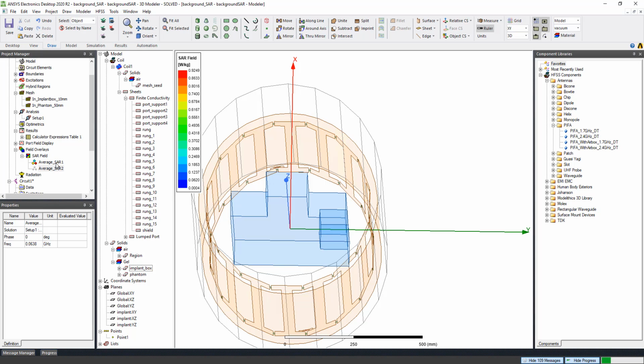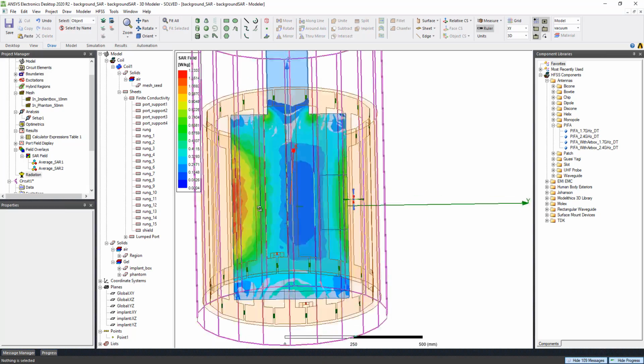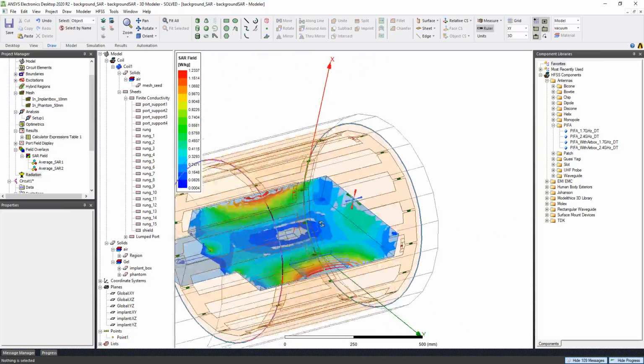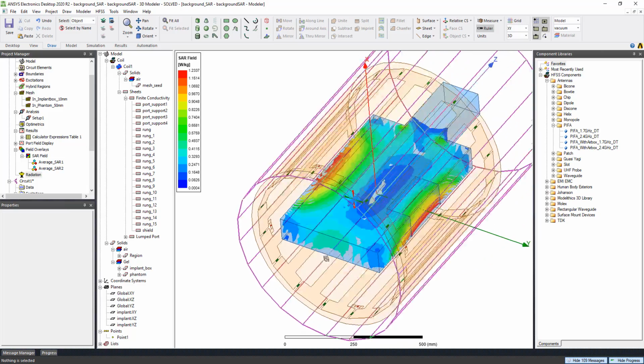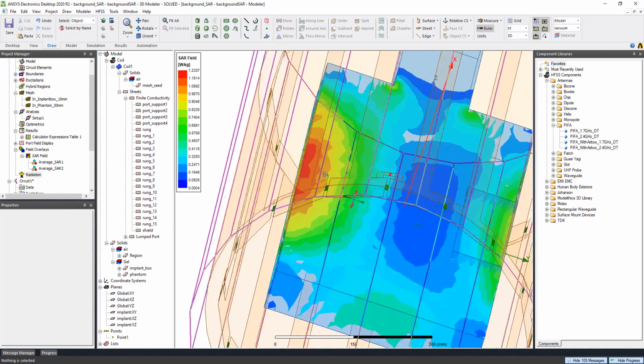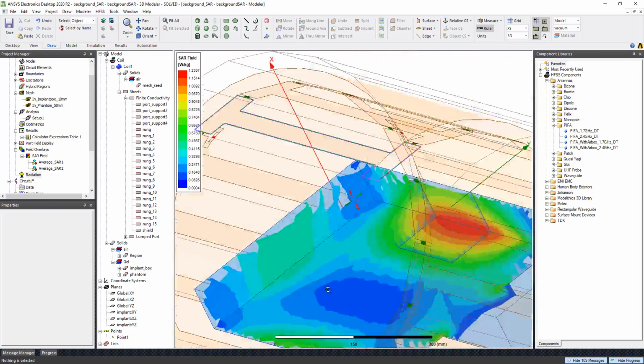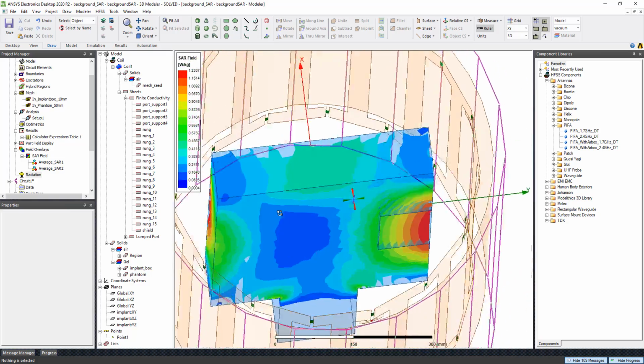So do I have anything come up yet? It's loading. It's coming up. There we go. And now we have the SAR over volume. So here we can clearly see where it has higher SAR values.